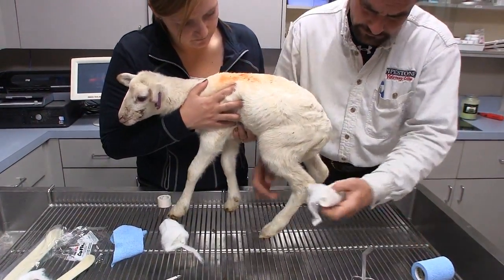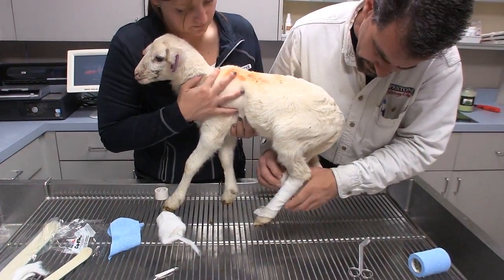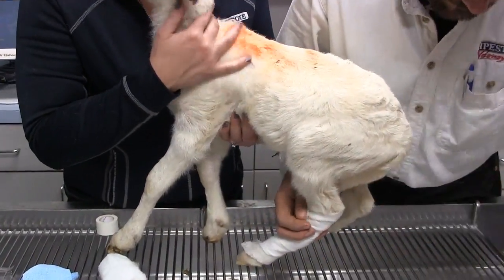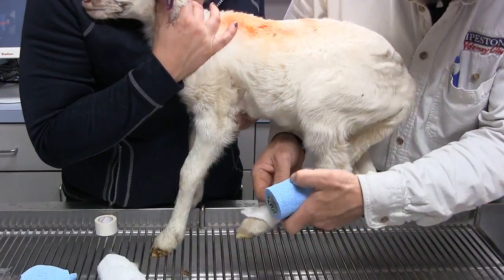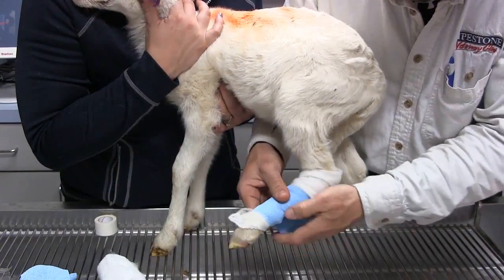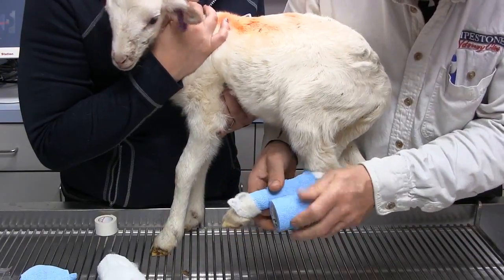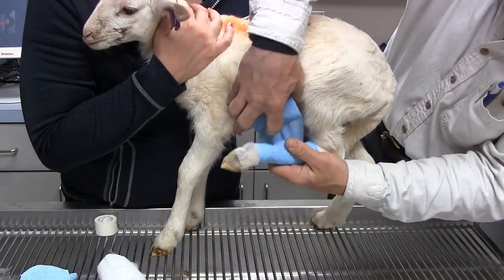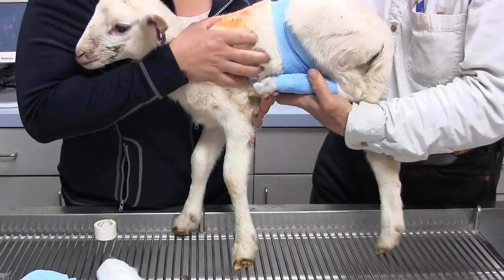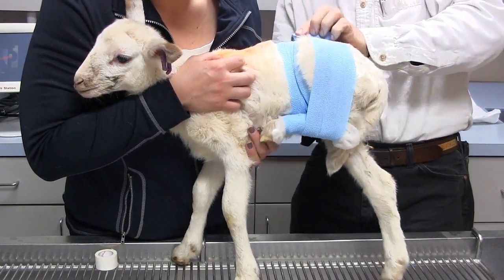We're now demonstrating in this fourth video segment how to stabilize a fracture above the hock. So again, we're padding the lower leg similar to what we did with the front leg. We're going to use some vet wrap. We're going to wrap it around the leg, and then we're going to pull the leg up against the body or fold it up similar to a chicken wing. So as you can see, we're wrapping it. Now we're going to go underneath the stifle and then back over the lamb. So the vet wrap goes underneath the leg, so it pulls it up close to his belly, and then we're wrapping over the top of the leg so it stays secure.